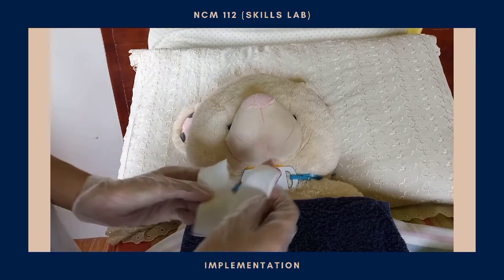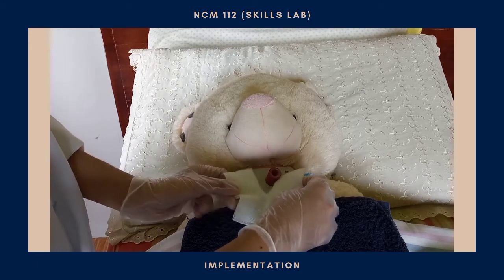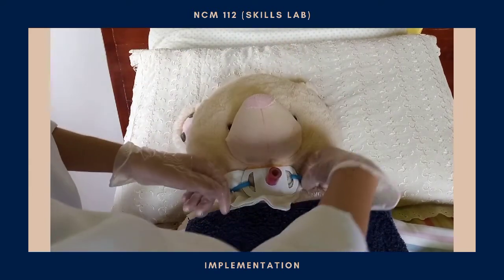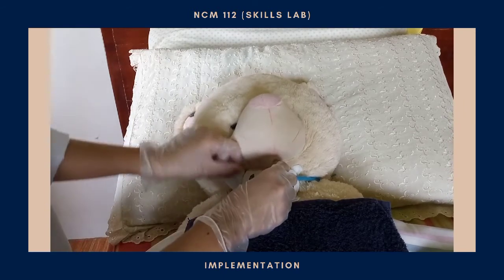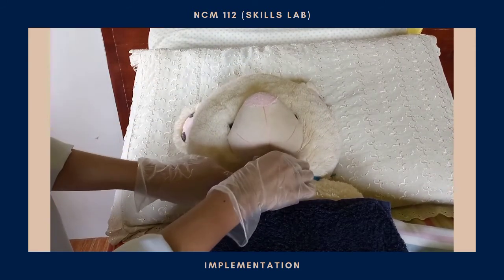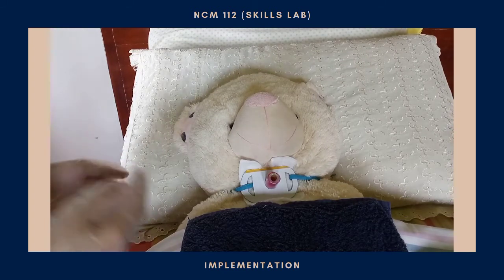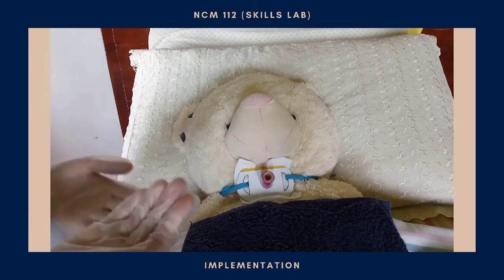Then, I'm going to slide the commercially prepared tracheostomy dressing or the pre-folded non-cotton filled 4x4 inch dressing under the faceplate and tie. Then, check the fit of the tracheostomy collar and you should be able to fit one finger between the neck and the collar. We must make sure that the patient can flex the neck comfortably.